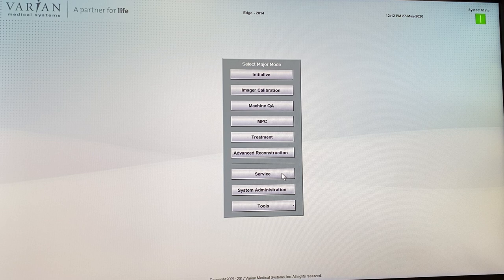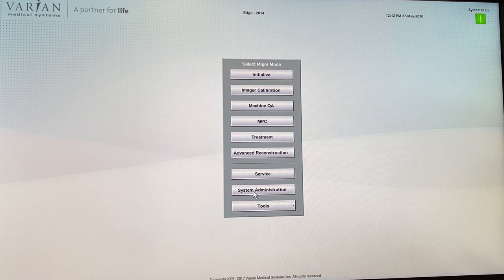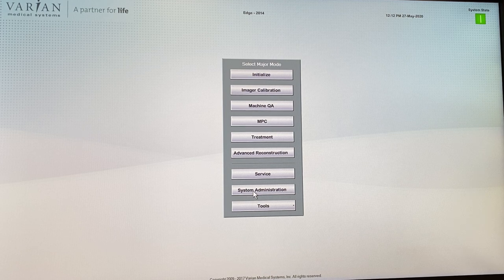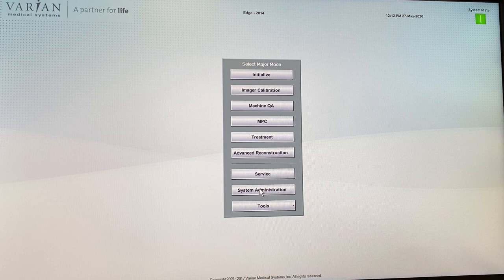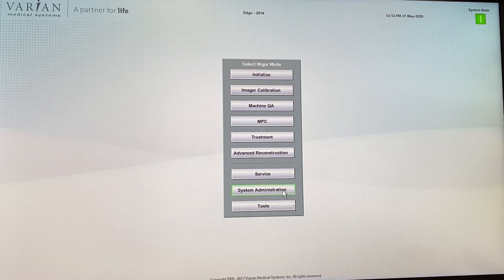Service mode is what we'll talk about shortly. In system administration, probably the most useful thing is the ability to turn on and off the machine's schedule. For example, over a holiday weekend the machines did not need to come on at 6 o'clock Monday morning, so in system administration we can tell the machine not to turn on at that time. Let me quickly show that. All modes of the machine require you to log on — we use your University of Toledo UTAD credentials.